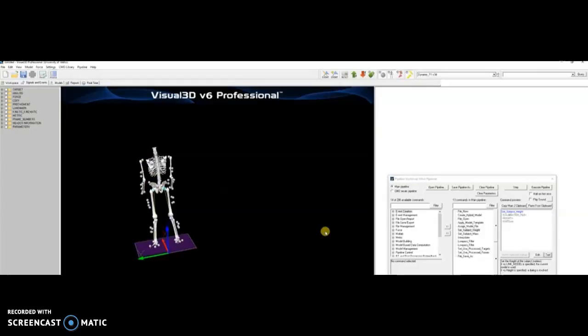And so on our end, we're just looking that shoulders are level, knees are level. That comes in for us when we do some data analysis a little later on.